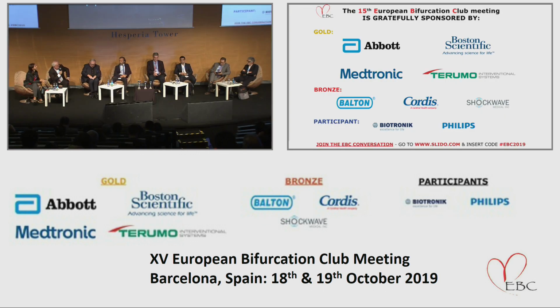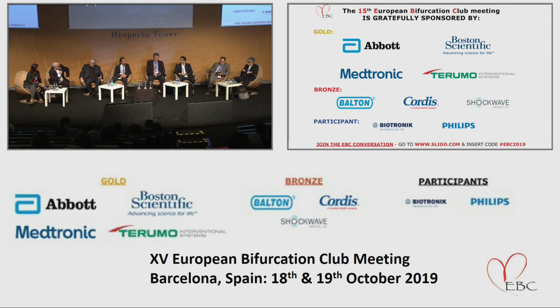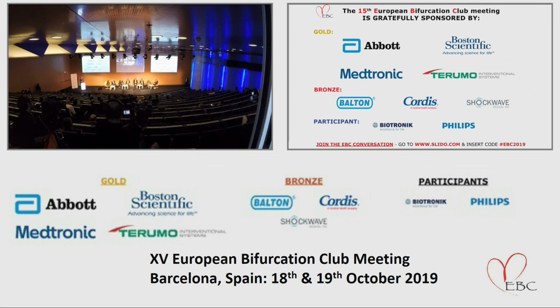Questions, remarks? A long time ago with Thierry, we had an experience of rotablation to treat restenosis, once in bare stents, and it was not working very well. But it was better than balloon. At that time, we were doing a lot of culotte with bare stents, and we had a 40%, 45% restenosis rate. It was treated by rotablation on both sides, and there was still a high rate of restenosis at the bifurcation.